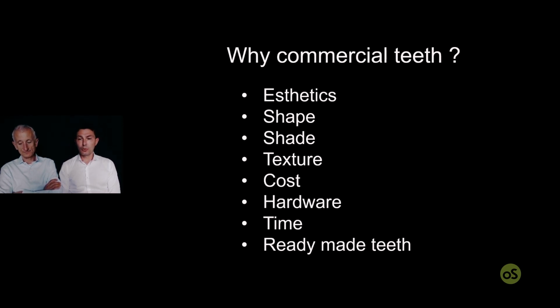And for sure, I cut a lot of time during the manufacturing because the aesthetics is ready-made, and you see immediately the new aesthetic of the patient when you place in position a new commercial tooth.